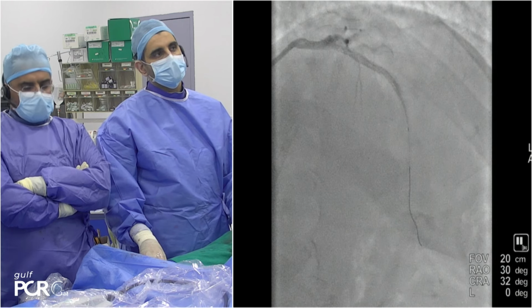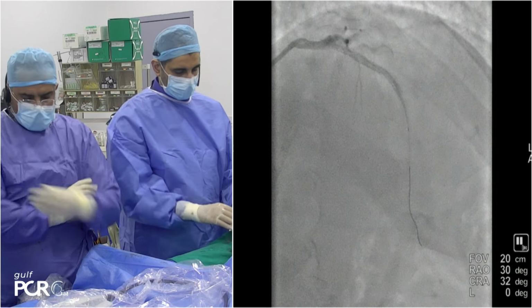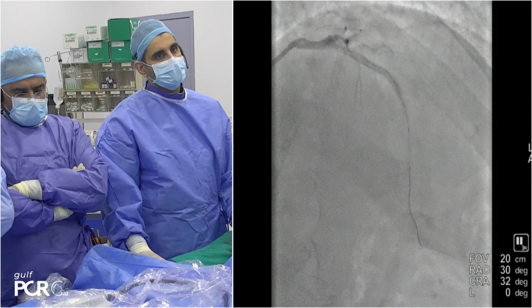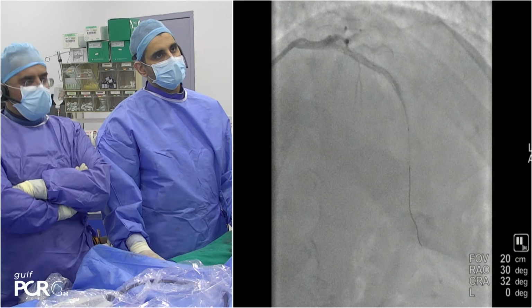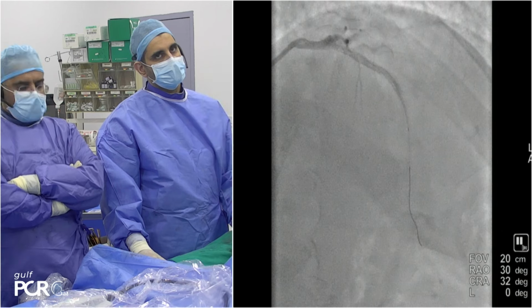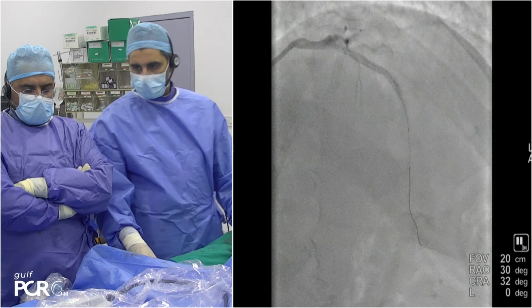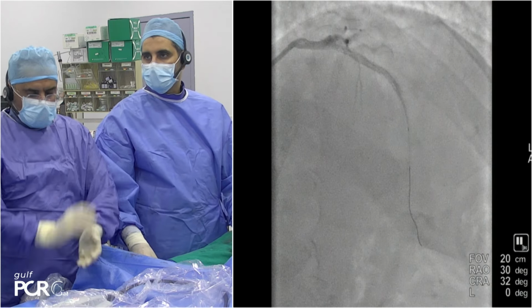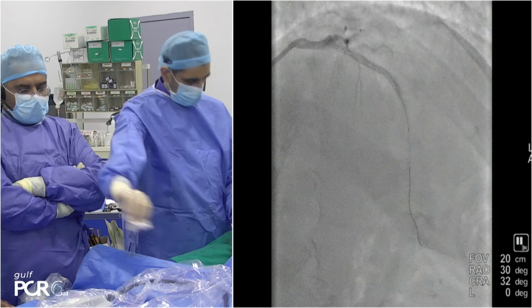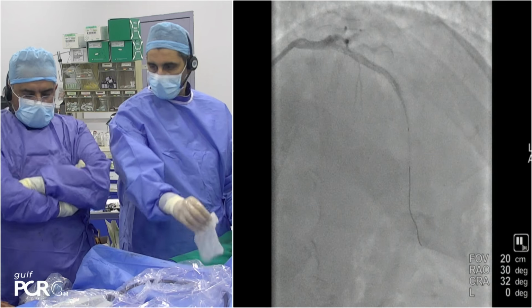What you could do in this particular case first, I think the stent is not 100% expanded. We have to avoid placing an additional stent because there is no visible good landing zone distally. So what you could do, and sometimes it's working, not all the time, is to place a short balloon, 2.25 or 2.5, with a low pressure and a long inflation time. 3-4 minutes inflation at low pressure, and sometimes you gain really impressive results after that. Sometimes it's working. That's an option. DCB, just a short one maybe, or a long inflation balloon.